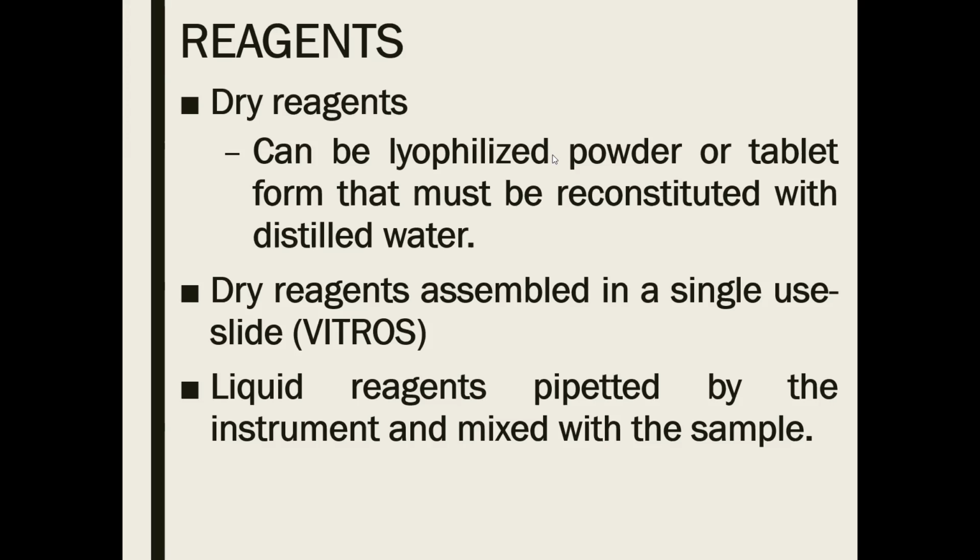Okay, so when we said reagents, there are dry reagents, like what I've said, commonly in a lyophilized powder or tablet form that we have to reconstitute using your distilled water. For dry reagents, such as your Vitros, meron po tayong mga dry slides na tinatawag. And liquid reagents na pipetted by the instrument and mixed with the sample. Yung pong ating dry slide, yung ating sample pumapatak sa dry slide, meron po yung mga layers and that layers will give us the analysis through the reaction of the light beam and the absorbance of the light beam.